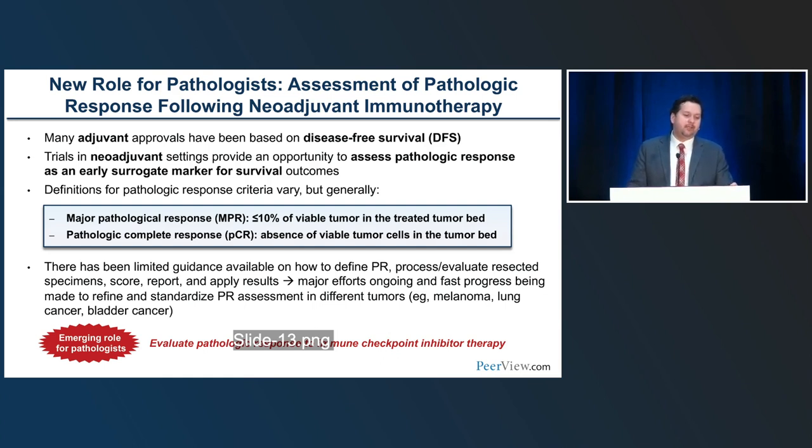The other interesting thing is that recent data has suggested that some of these metrics may be actually treatment dependent. And I will touch briefly on that relative to the effect of immunotherapy, targeted therapies, or chemotherapies, and how they can actually impact the specimen.